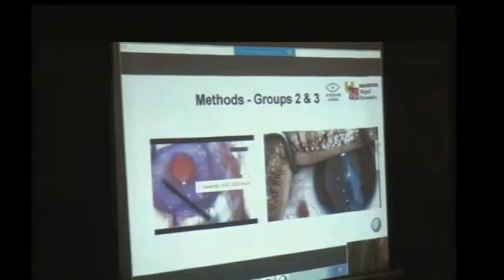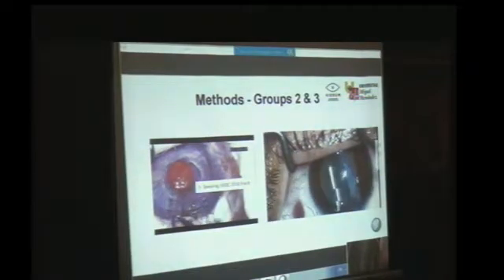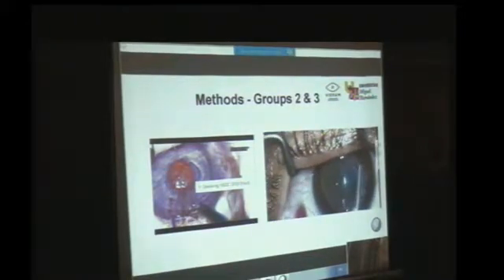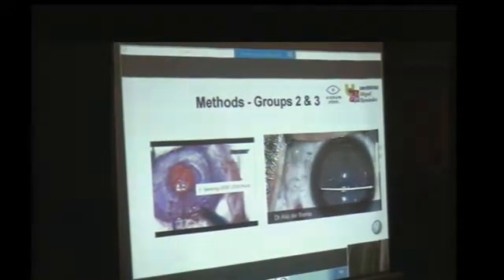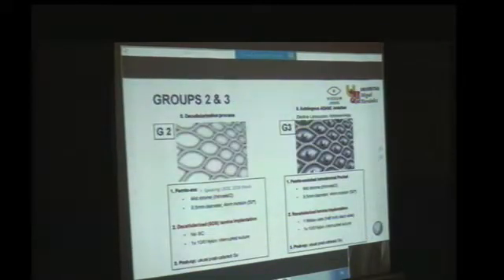It's remarkable how these laminas are expandable into the pocket, and the surgery took minutes, and we use only one stitch in order to secure the entrance of this lamina. So look here how we are finishing the expansion of the lamina in this case, and this was the end of the experience. We have in this case included keratoconus with very advanced conditions.